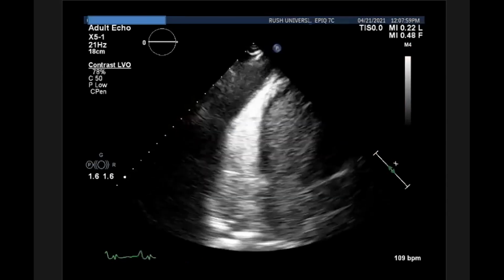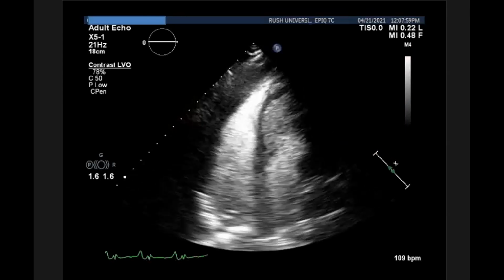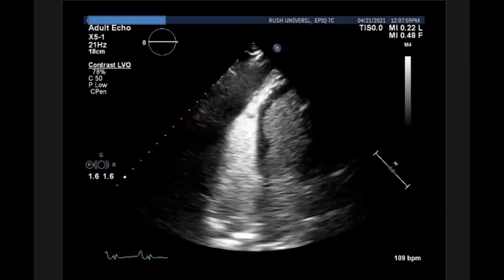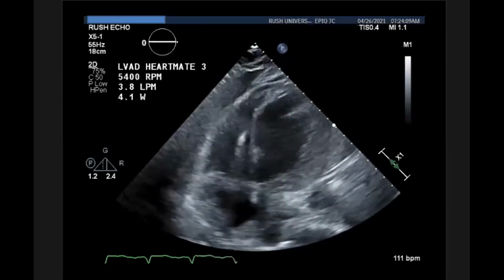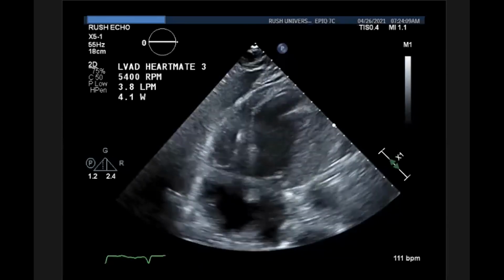After careful waiting and patience, this patient, you can see 20 days after LVAD, the RV function is returning. The RV is smaller. And here's an image without IV contrast enhancing agent. Pericardial effusion is still present but stable, but the RV function has started to return.